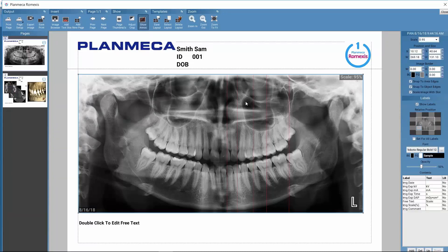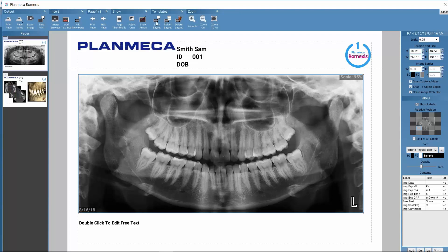Let's take a look at some further adjustments. In this panoramic image I have some annotations. If I would like to print out the original image instead, I can use the 'Show Annotations' button to deactivate it, and now the annotations are hidden. This only hides annotations made in the 2D imaging module — unfortunately, annotations made in the 3D imaging module cannot be removed here.